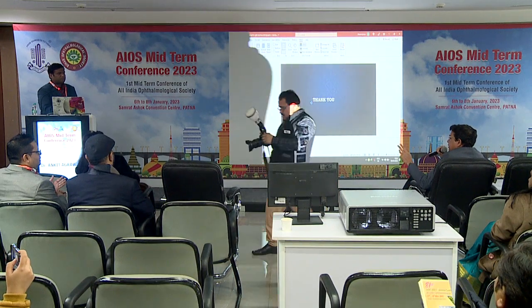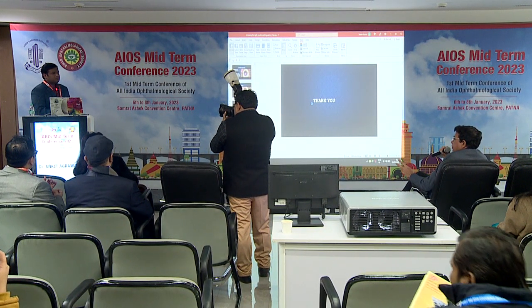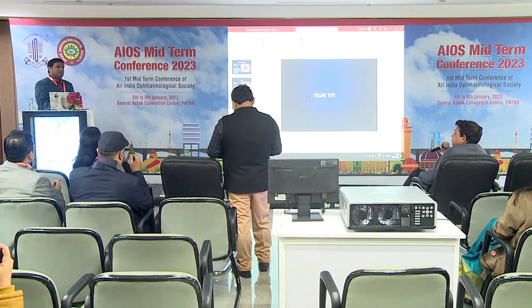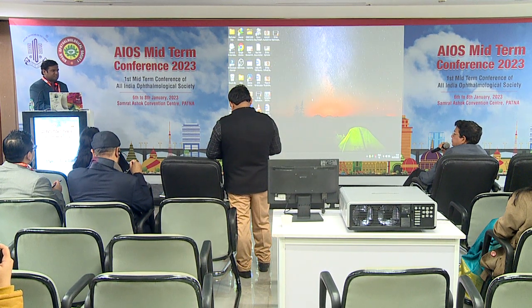Just one question. Do you use longitudinal and torsional phaco or ellipsoid phaco? What's your choice? Do you always use one type? Right now I'm using the Signature Pro machine, so ellipse I use for all the cases.